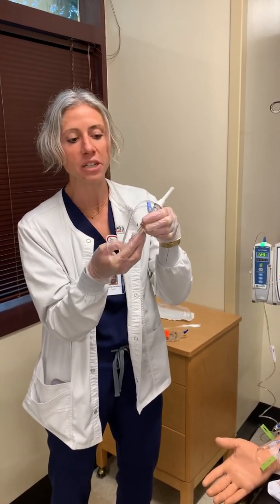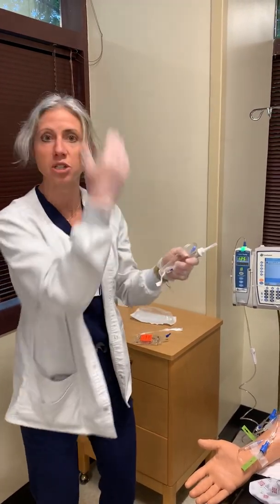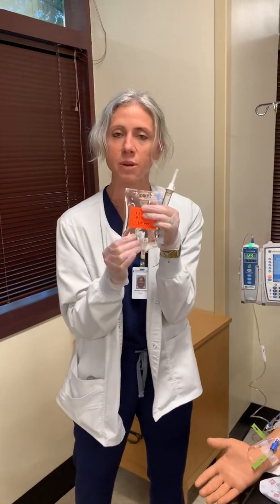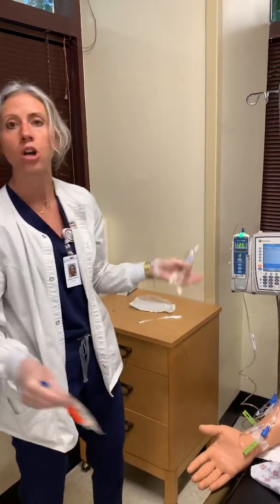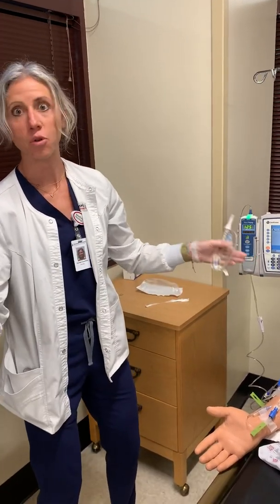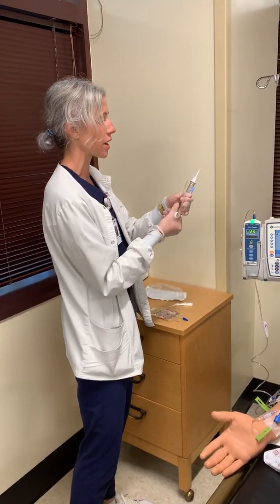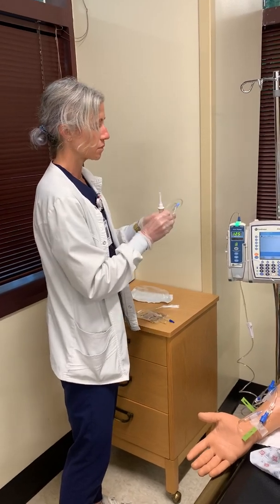Because if it's open, know that these are always gonna automatically be open, okay? If you stick it through, it's gonna gush through, and I want him to get every little drop of this. Especially when we're hanging really important medications, they need every drop in this bag, okay? So I don't wanna risk blowing it all over the floor, which you'll be surprised, but it happens all the time. So safety measure, make sure that's all the way locked, okay? So we got that.